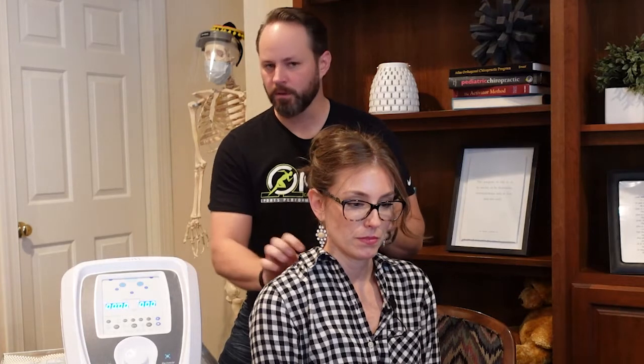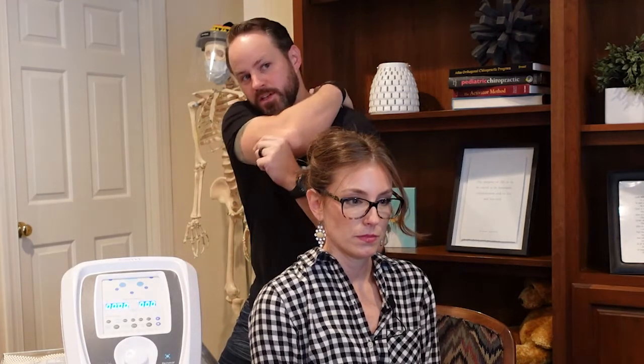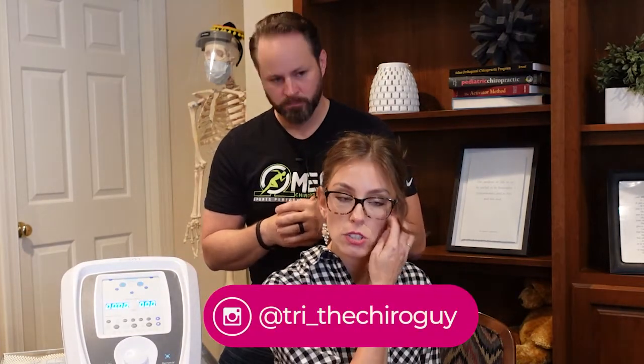She's kind of dealing with a little upper back, lower neck issues that we want to address. So I put them in an X pattern. One here, one on the other side of the mid back, and then on the lower part of the neck, and then the other side. So that X marks the spot where I want to get her affected area to improve. Which is what y'all need to do. If you have TENS units at home, that's how you should set up your X marks the spot, too. Not, hey, I'm going to put it where it only hurts.